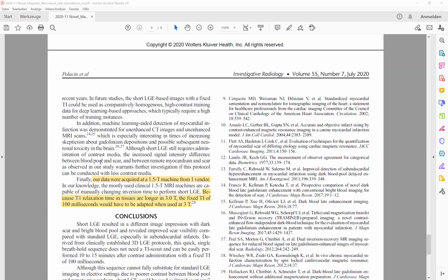Okay, so we saw amyloidosis with this. It was a mixed protocol where we tried to rule out pretty much everything, and he had amyloidosis. And you could see it like dark spots, but I think for diffuse LGE, it's not the best method, because then you could use normal LGE, because the distinction between blood pool and subendocardium is not so important in those patients. You see it, but not very nicely, to be honest, there's not much benefit in the sequence.